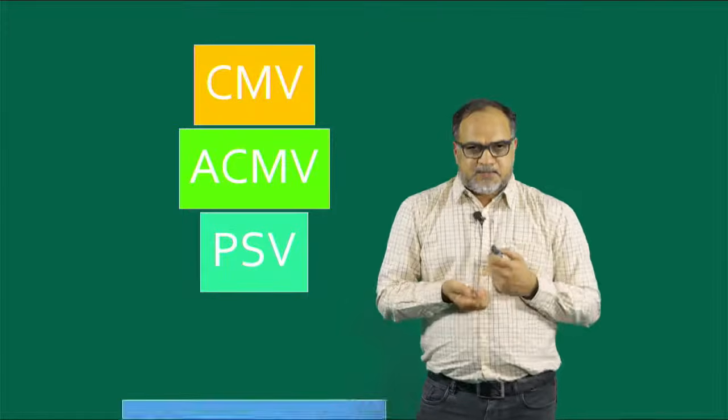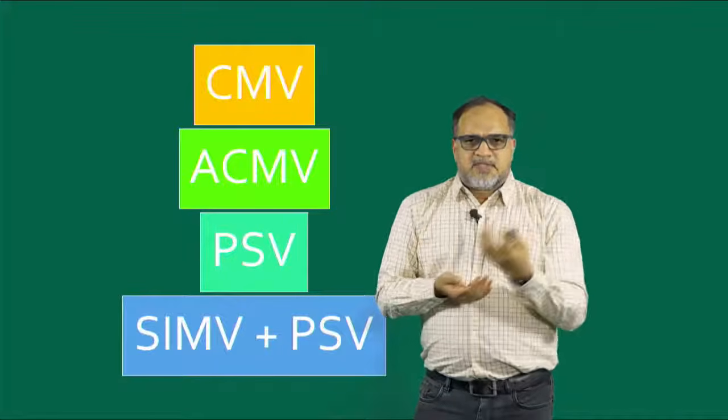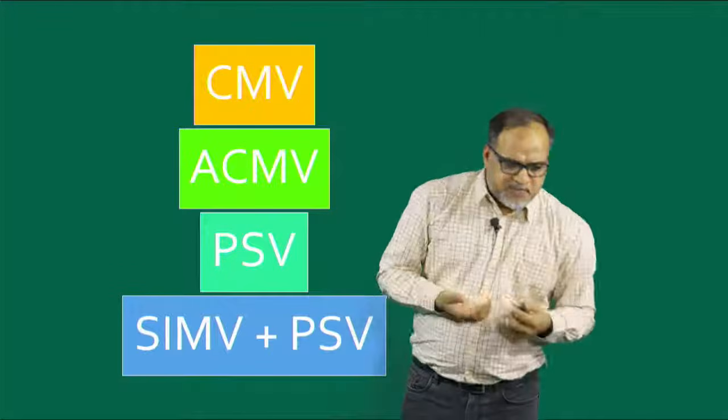So now he asked us, what are the modes I can give? So there are 4 ways you can deliver this air. These are CMV, ACMV, PSV, SIMV plus PSV. Let's go there one by one.